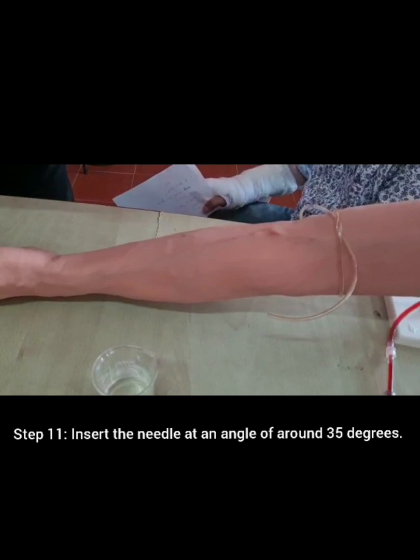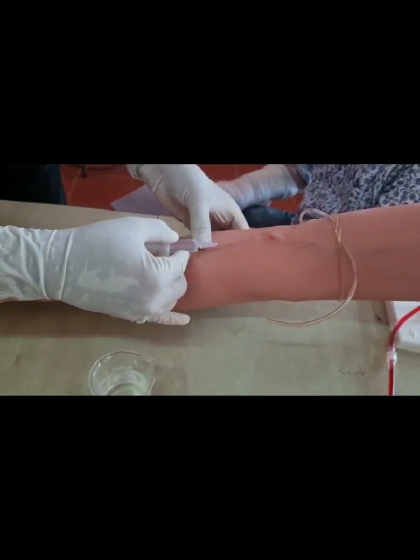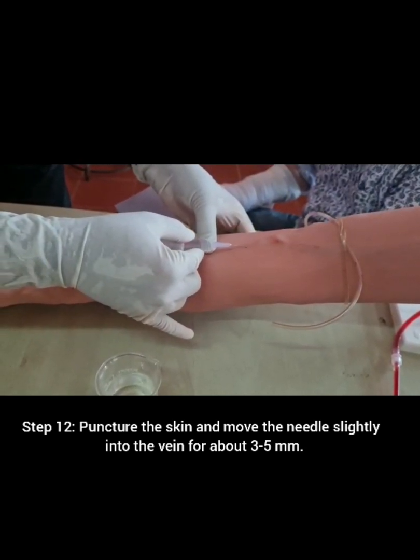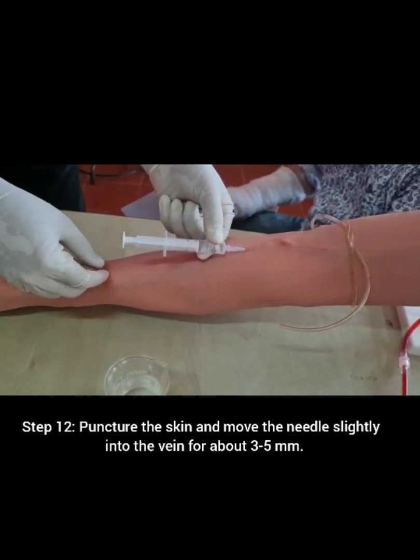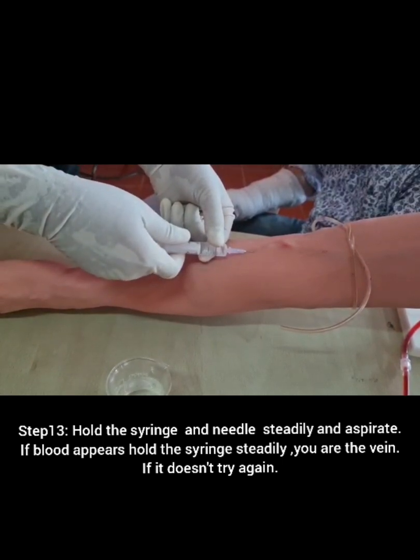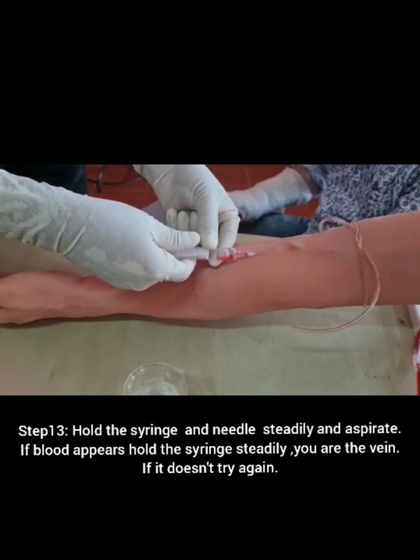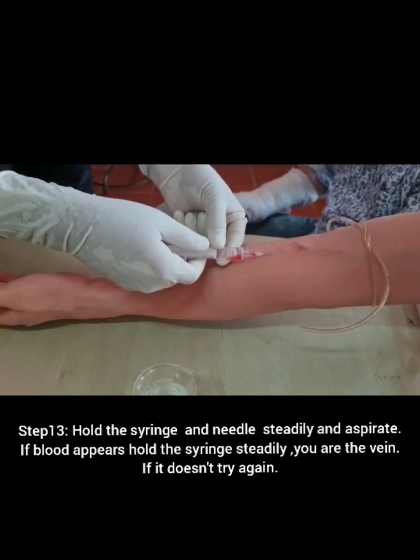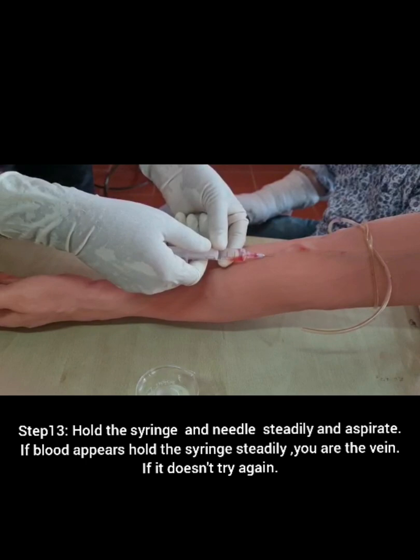Insert the needle at an angle of around 35 degrees. Puncture the skin and move the needle slightly into the vein for about 3 to 5 millimeters. Hold the syringe and needle steadily and aspirate. If blood appears, hold the syringe steadily — you are in the vein. If it does not, try again.